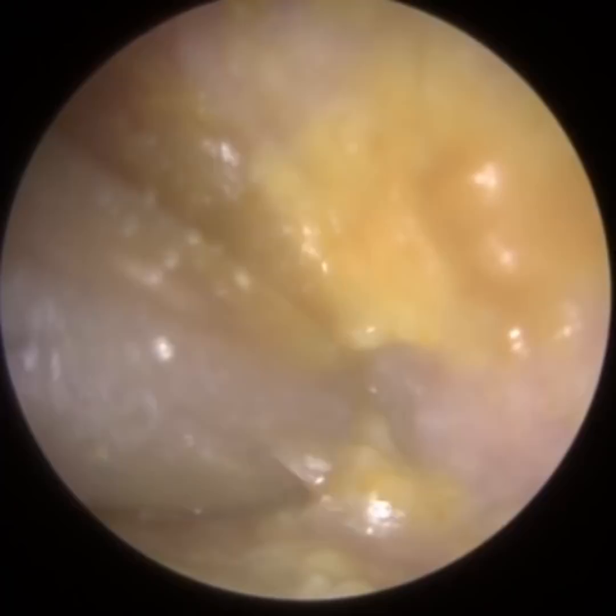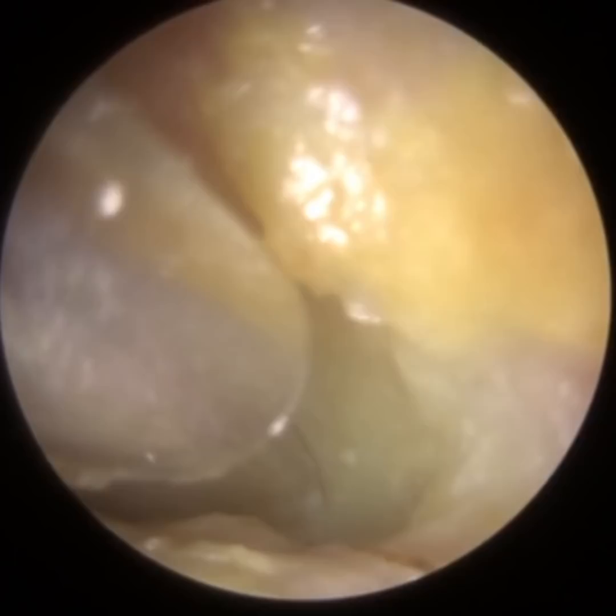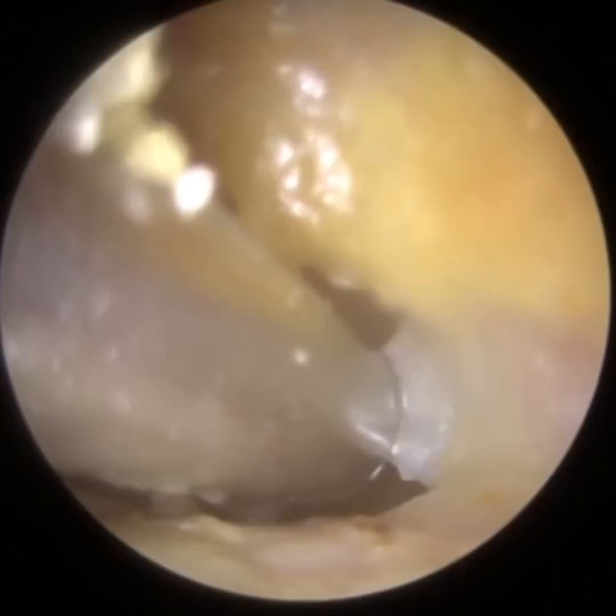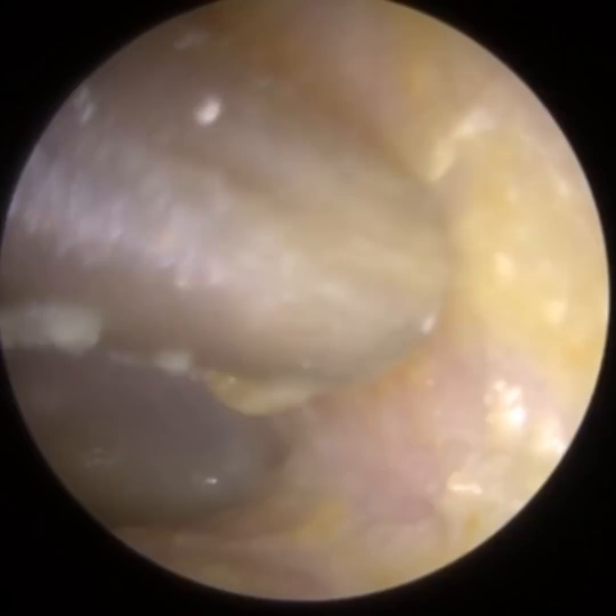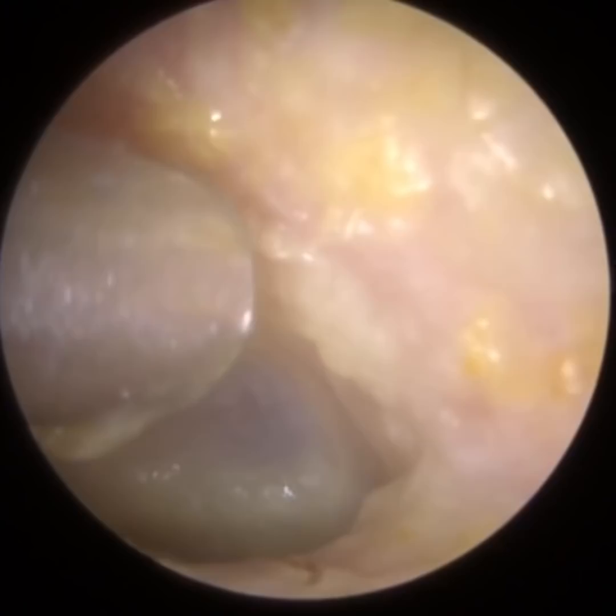The priority here is to minimise contact with the canal wall because it can be uncomfortable. The patient's ear canal is quite bendy and twisty, so the second bend is quite prominent. The endoscope is actually facing too straight into the ear, and you can see the eardrum is to the left. We'll have to accommodate that bend, and you'll see the eardrum come into focus in the middle of the screen as we delicately remove the oil.